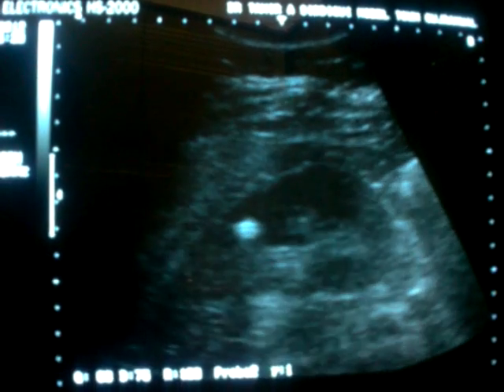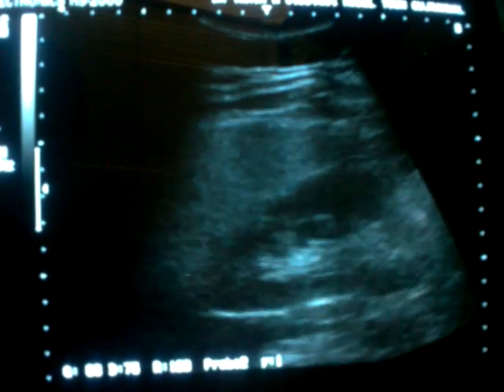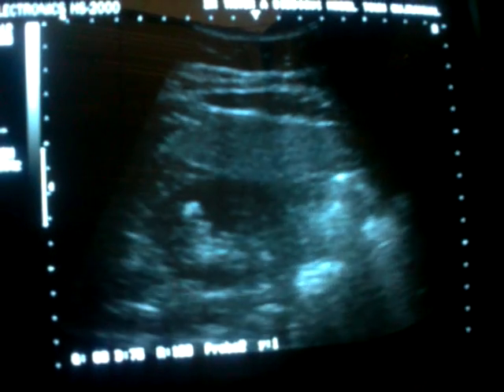I want to assure you: this is not a renal calculus. Don't confuse it with renal calculi. Renal calculi will be seen in the central sinus complex, in the collecting system in this area. On the transverse section, you will see this echogenic area to be absolutely separate from the central sinus complex. This is the transverse section — this is the central sinus complex, and this is the echogenic area which is in the region of the medulla, not in the central sinus complex or the collecting system.